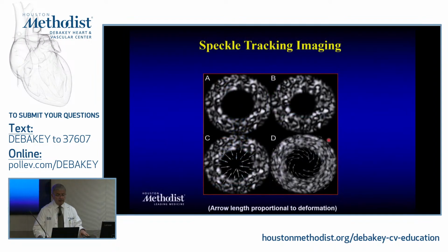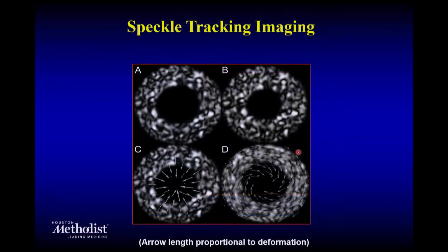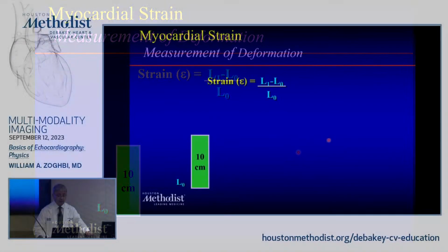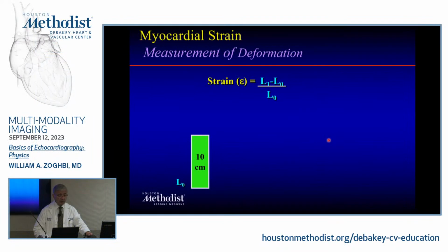So now you could take, I mean, we're not going to spend too much time on this, but speckle tracking, actually I was at the first presentation, I was wowed by it, because in the past it was hard to track where each speckle of the muscle was going during the cardiac cycle. And with this advancement, you could do speckle tracking, and therefore you could evaluate many things. One of them is strain. You use global longitudinal strain. Strain is, what is it? It is a deformation of a structure.